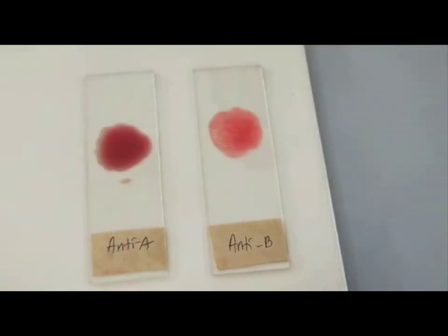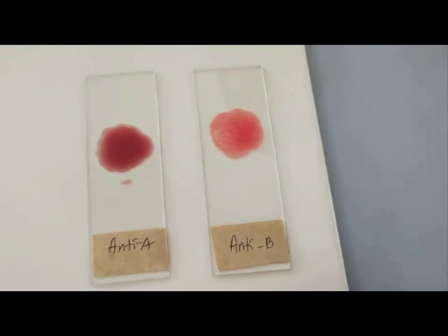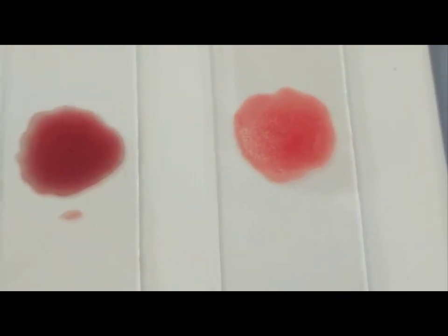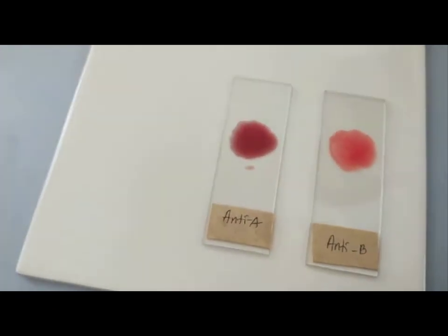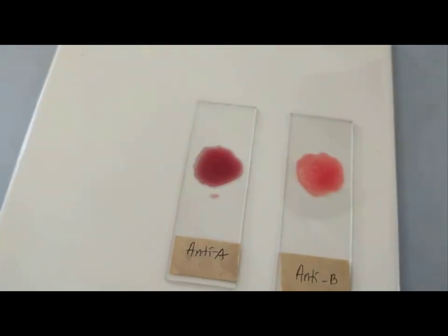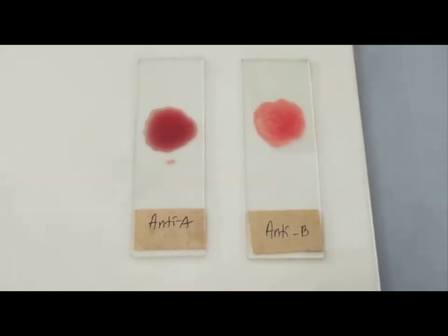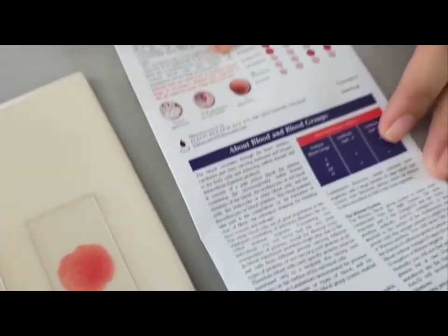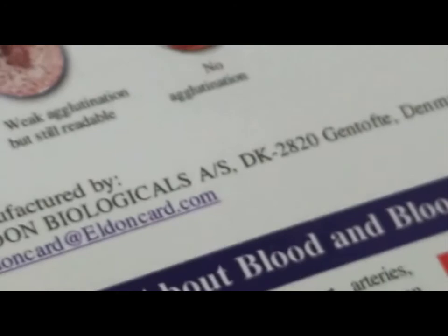For this video, we wanted to show an example of the outcome. If you look at these two different slides, that is to show how different the appearance of the agglutination is compared to the one that doesn't agglutinate. So this shows that the person belongs to B blood group, as shown in this guideline.